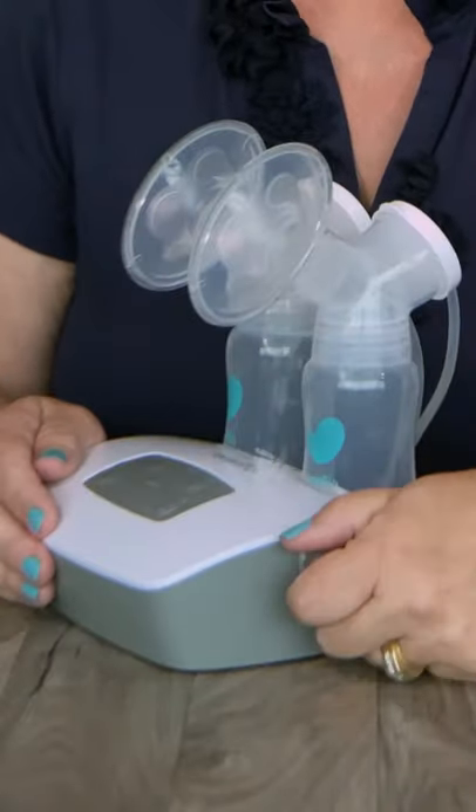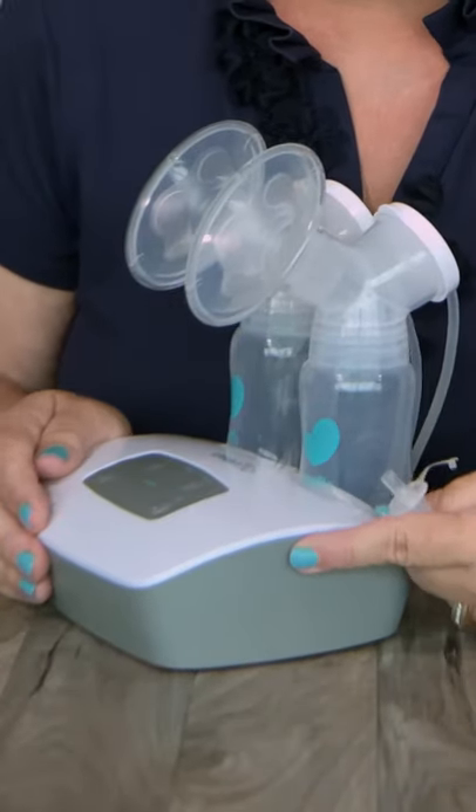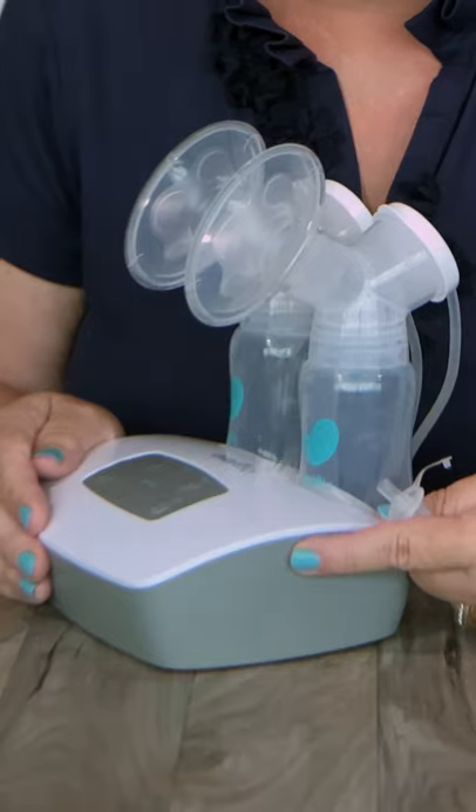Five quick things to check if you don't think your pump has enough suction. First, remove the tubing adapter and place your finger over the hole when your pump is on. You should feel suction.